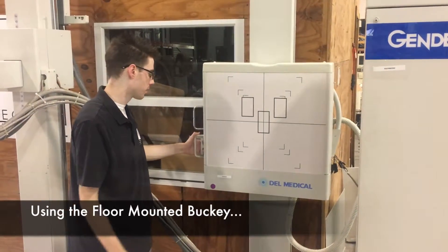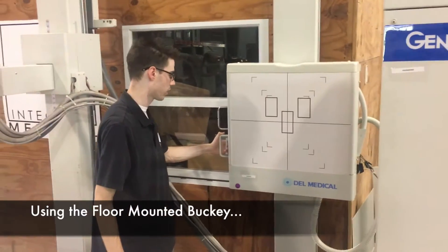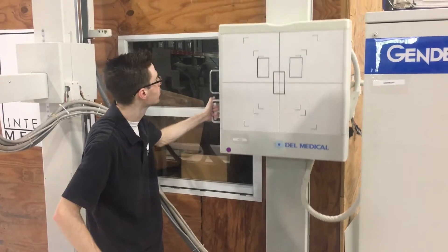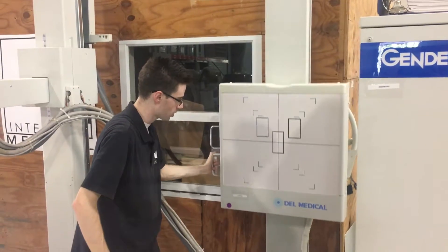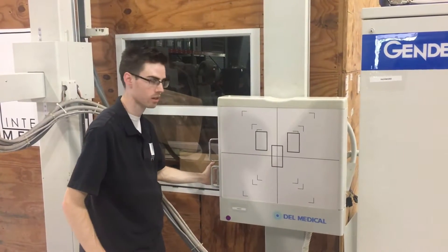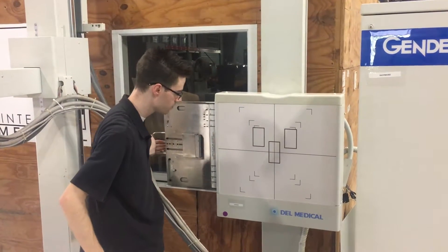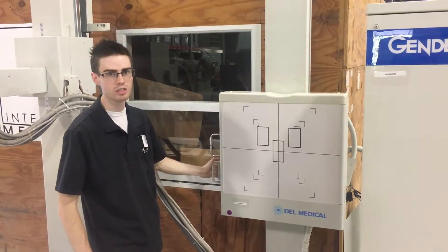The floor-mounted bucky can be adjusted with mechanical locks. Just pull right here and you can move it up or down. Release and it will stay. And right here is where you can put the cassette in. And that is how the bucky works.